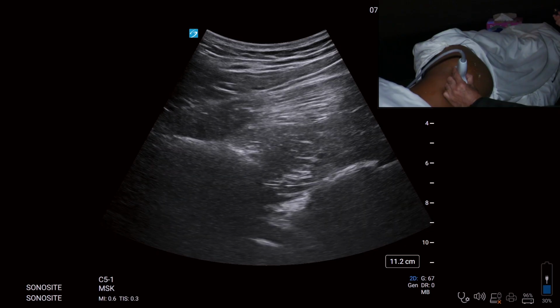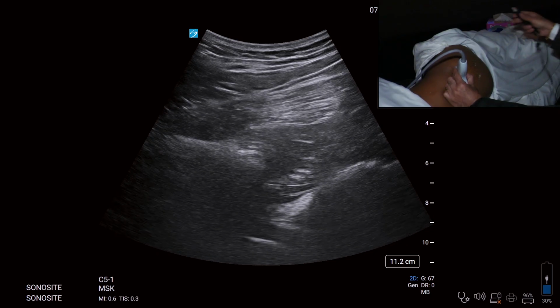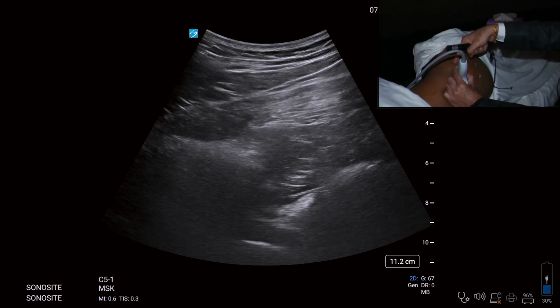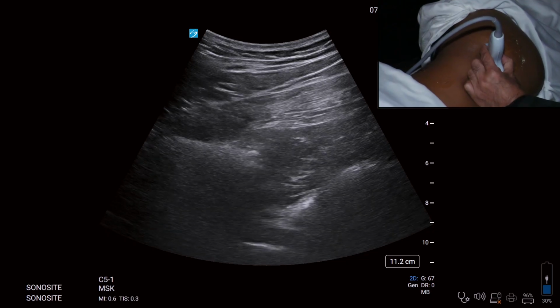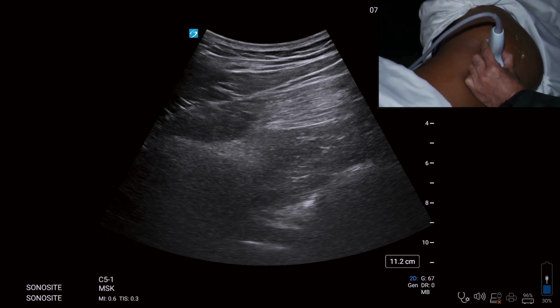So what is this? The plexus. So plexus is situated almost at 9 centimeters. He's a robust guy, 70 kg. So what do I need to do? I get my needle from the lateral side, my dear friends, here, go up till this point and use the dual guidance, that is peripheral nerve stimulator along with it. I'll get the hamstring twitch or the dorsiflexion or the plantar flexion.